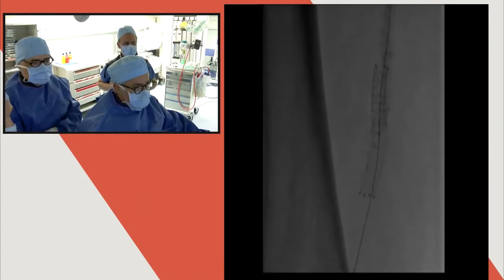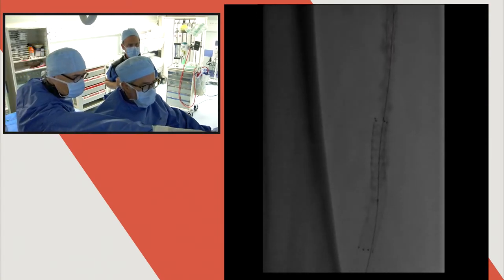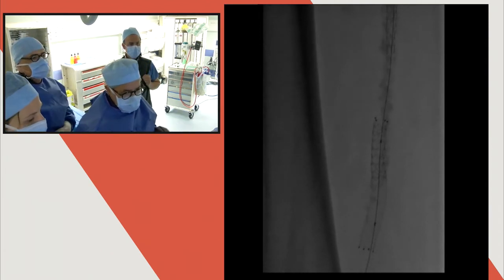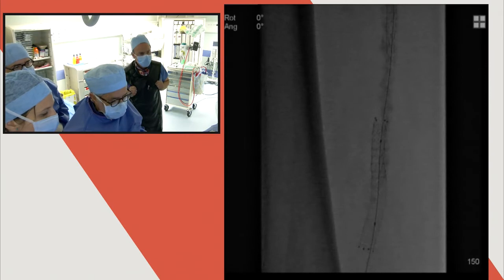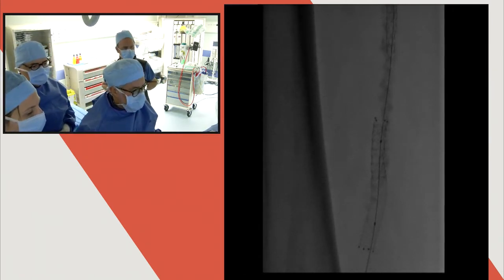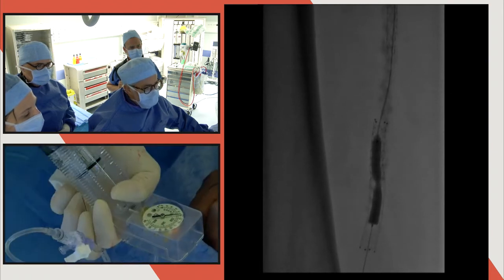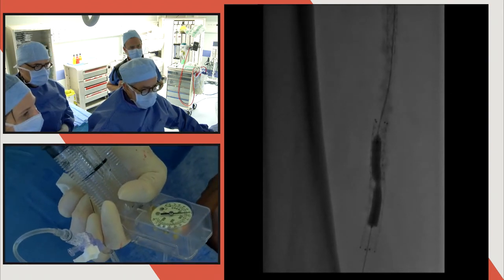It was in the middle of the stent. No, more distal. The restenosis is here, inside, further down, just in the middle of this transition zone. It's 5 millimeter by 4 centimeter. Stenosis, there you go. Very short, it's very focal, huh? Resistant lesion here.